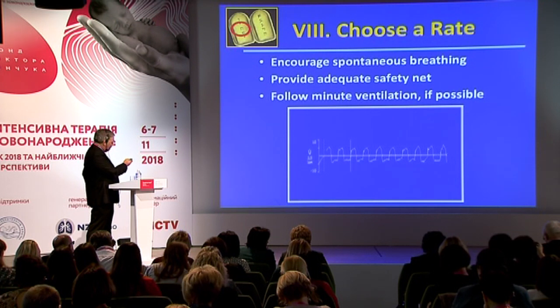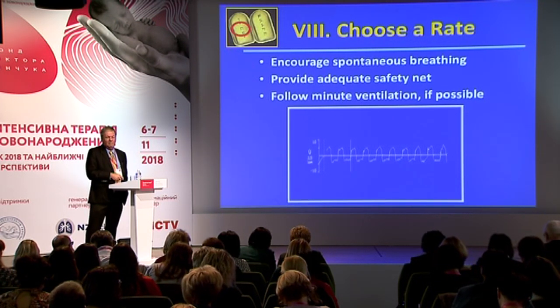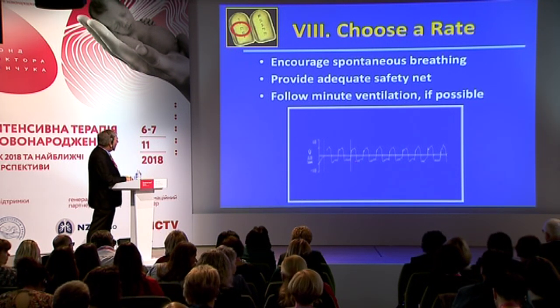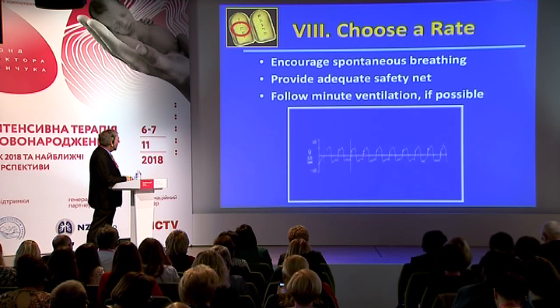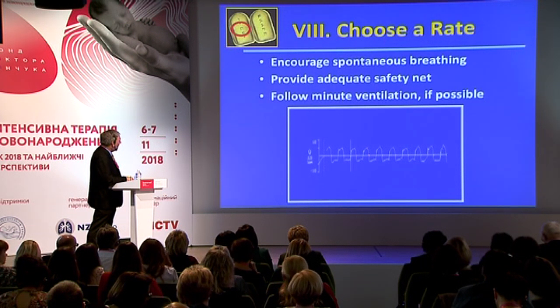Now on this graphic, I show you what happens if the ventilator rate is too high. This baby is demonstrating gas trapping. And how you can tell that is if we look at any one of these flow waveforms, here's our accelerating, our peak, our decelerating inspiration.